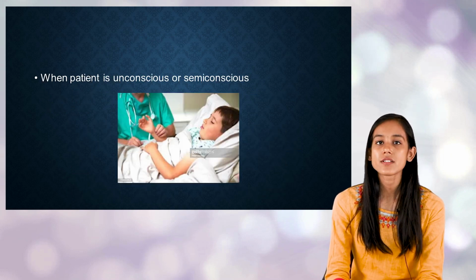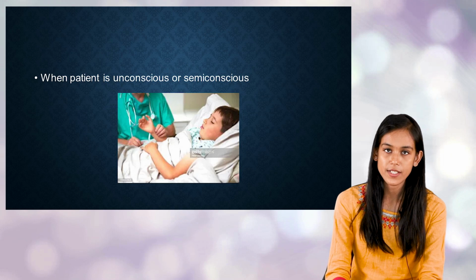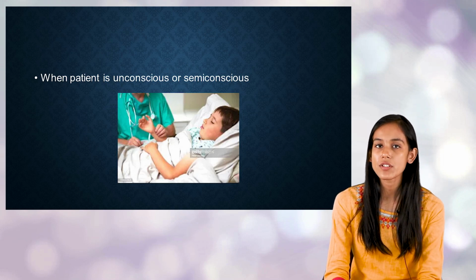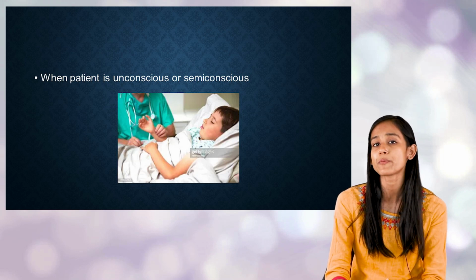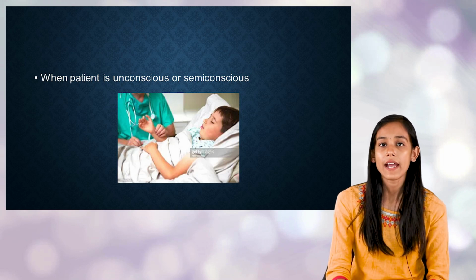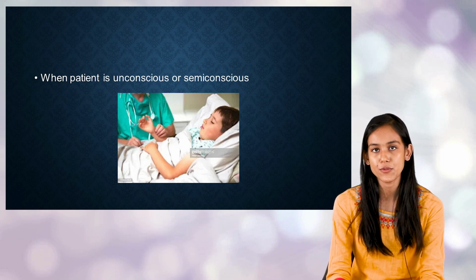The next thing is when the patient is unconscious or semi-conscious. If the patient is unconscious or semi-conscious, the patient cannot take food orally, they won't be able to swallow the food, and that's the reason we are going to use NG tube feeding.